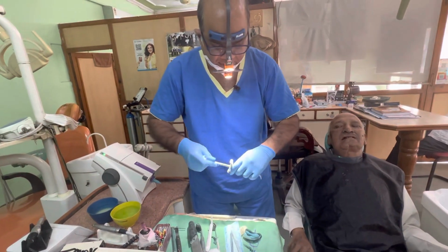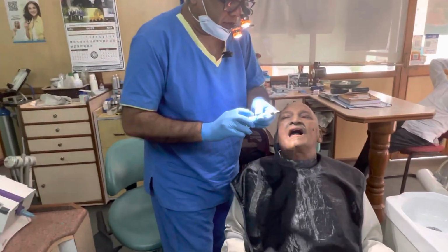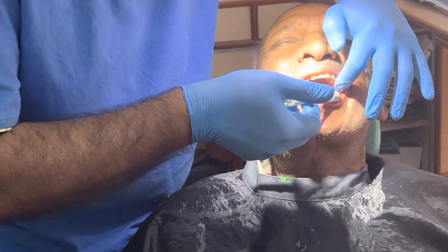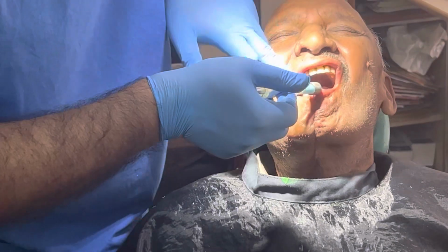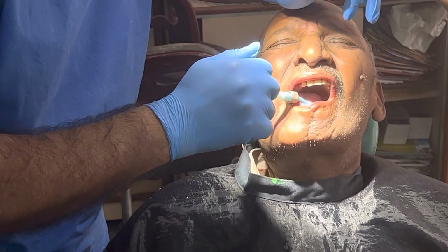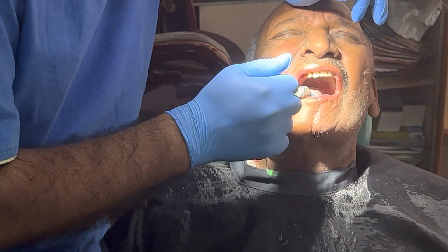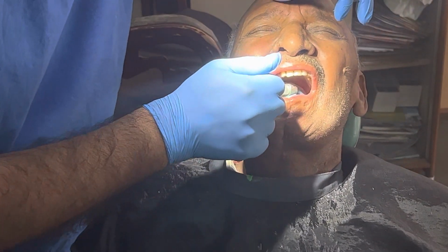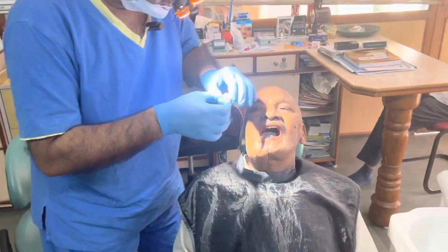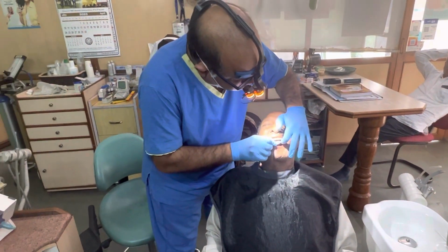Just slightly fill it so that we can easily push it into the sulcus area and interdental spaces. There are many undercuts, so first you have to remove those undercuts and then make these impressions.